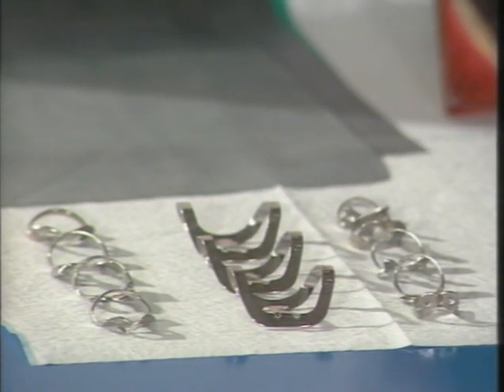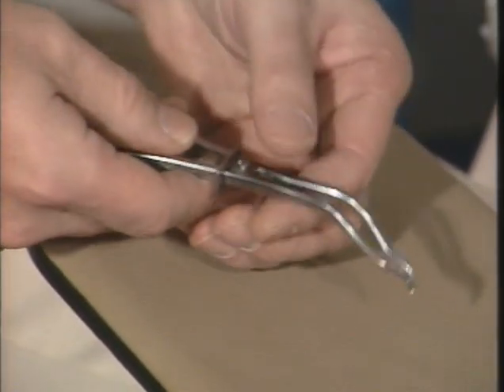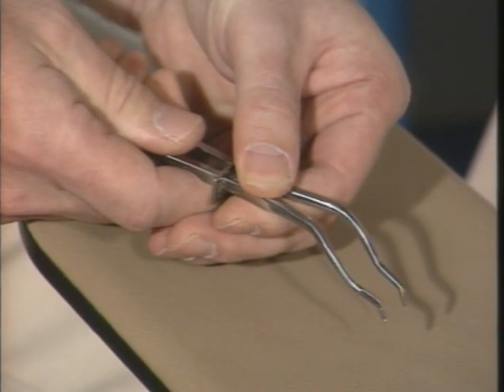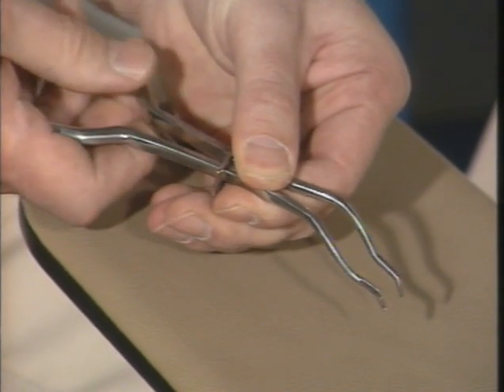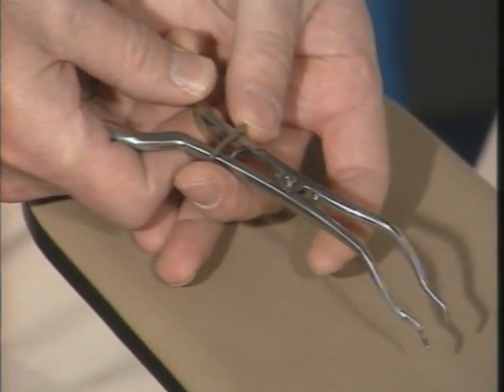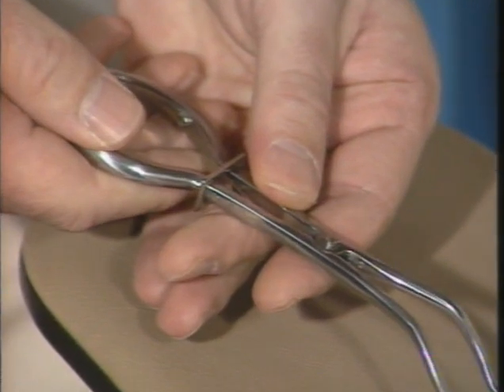To secure the rubber dam to the teeth, you'll need to use one of a range of rubber dam clamps. The rubber dam clamp itself is carried to the tooth using a pair of rubber dam clamp forceps. These are designed so that they can widen the gap between the jaws of the clamp so that it can be stretched over the tooth. And so that it can be held in that position for carriage to the mouth, there is this locking device which enables you to do that.